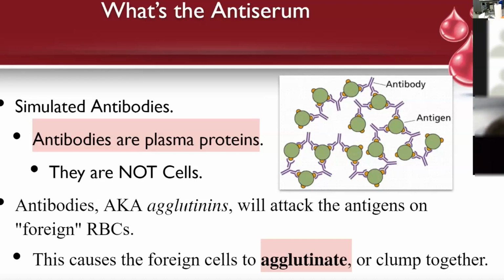So pretend I did it for all 3. You got a marker in here so you can write down who each one is, or you can use pencil, but keep track of who your people are. So then, all right, I'll do it. There's anti-B and anti-RH.